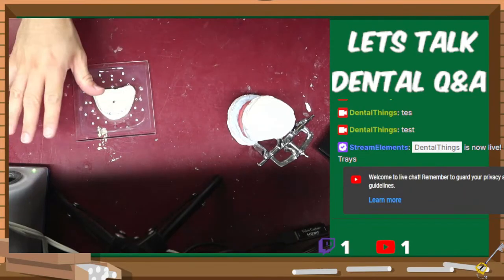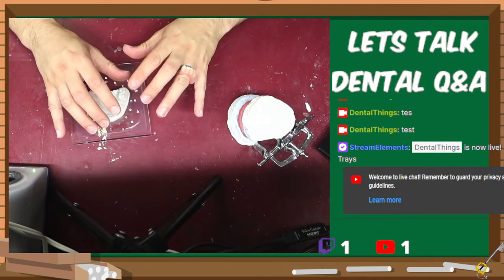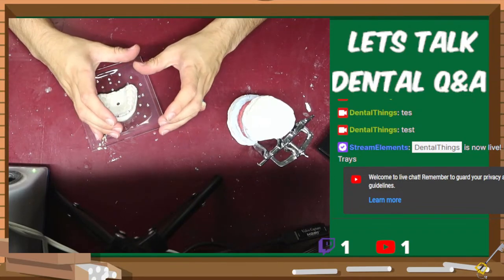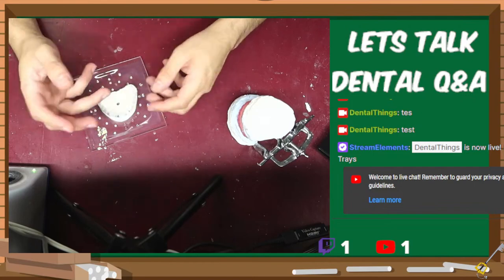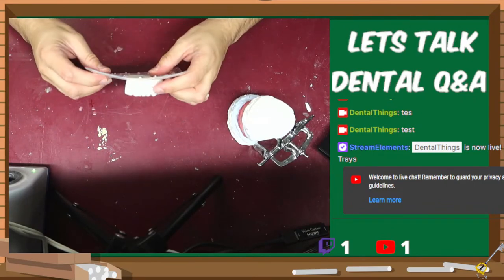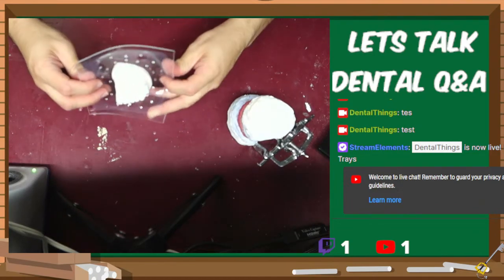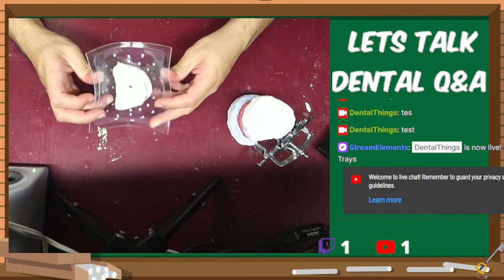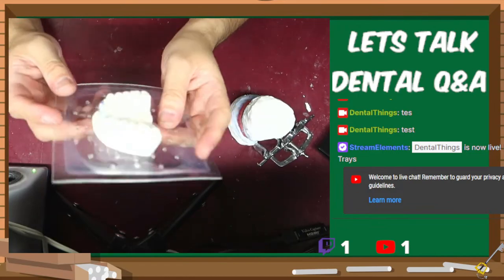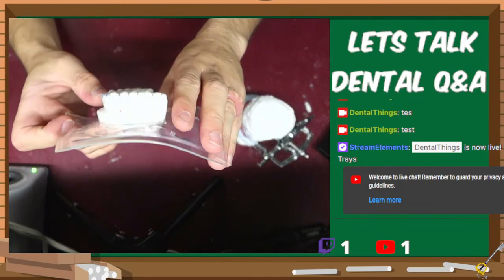So this machine that I had over here a moment ago is called a vacuum former. It has a vacuum all the way at the bottom, and as it pulls air in, once we have this material, which is plastic, and we melt it really good, it'll melt a little bit, and it will fall, and I'll push it down onto this model, and then it's going to suction around and make a mouth guard.